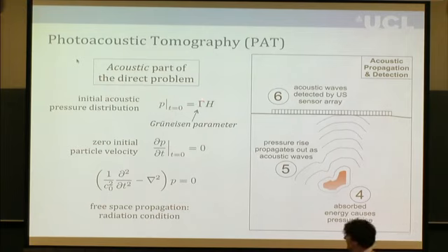We've got some constant of proportionality. We've also got another condition which we assume when we're building the model for this, which is that the optical energy is delivered, all of it, before anything in the tissue starts to move. So the light comes in and scatters around, and that all happens and gets absorbed in maybe a few nanoseconds. The pulses are typically 5 nanoseconds. So after about that sort of time, all the light that's going to be absorbed has been absorbed, and we assume that the tissue hasn't had time to mechanically move. That's why you get an increase in pressure, in particular, because there's no change in the density. So we make this assumption that the initial particle velocity is 0, or if we're talking about pressure, the rate of change of the pressure is 0. Okay.